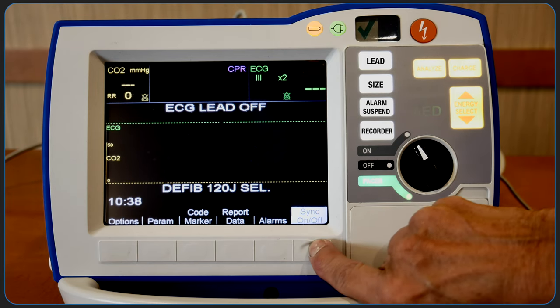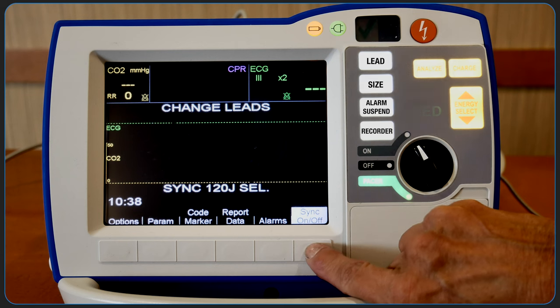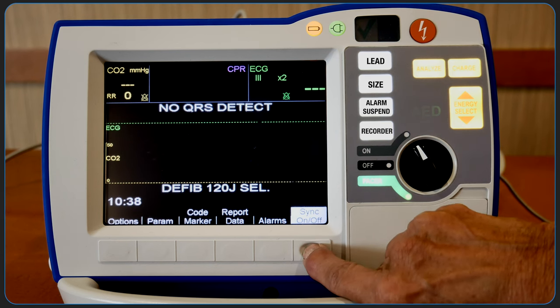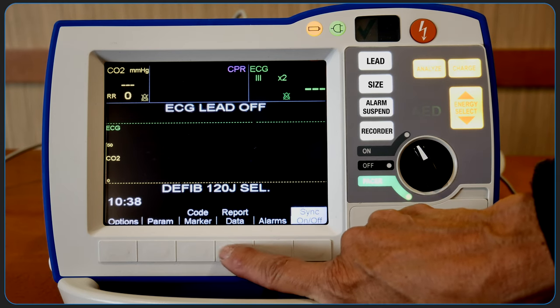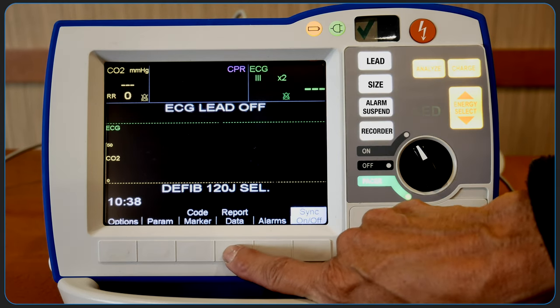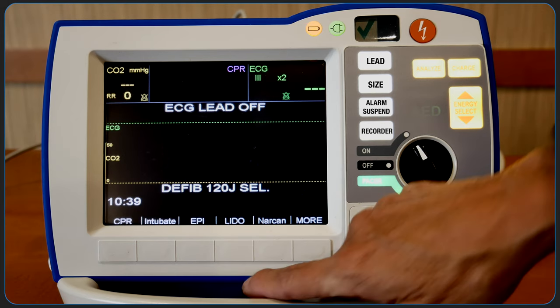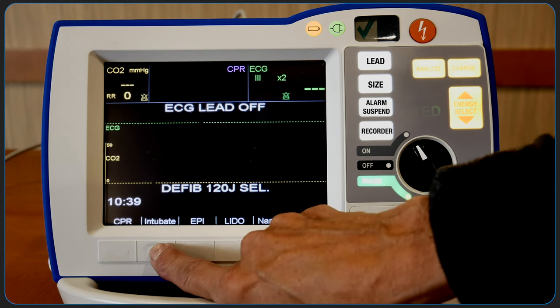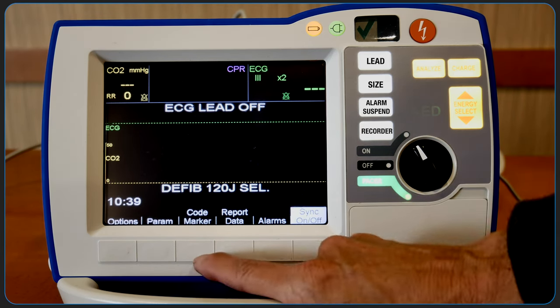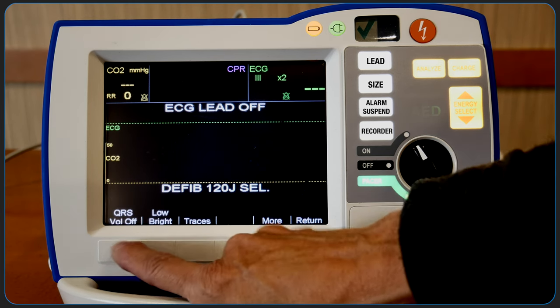We'll now review the soft keys on the front of the display. Pressing the sync on-off key toggles sync mode for synchronized cardioversion. This is the key for alarm settings. Report data allows for printing of recorded information. Pushing the code marker key shows a list of clinical actions. Pressing the key associated with a particular action causes that action and 6 seconds of ECG to be recorded along with a date and time stamp. Some additional settings are also available here.